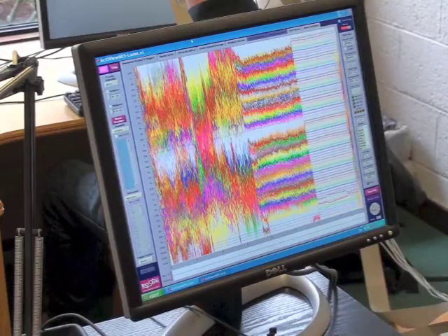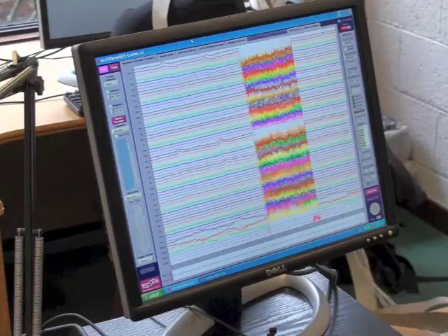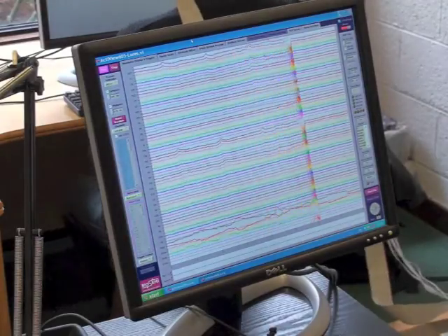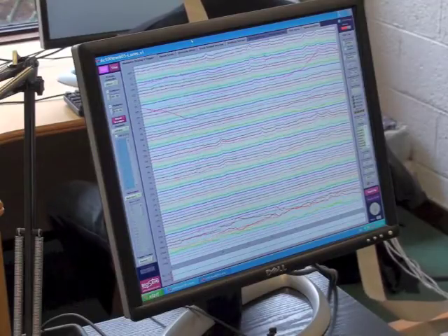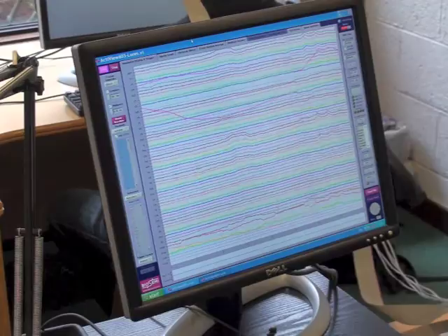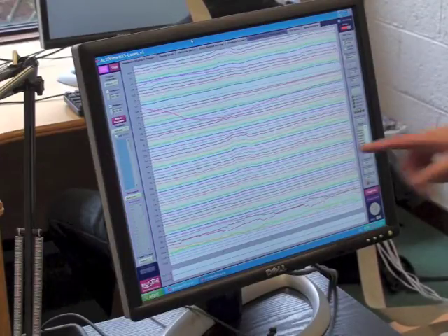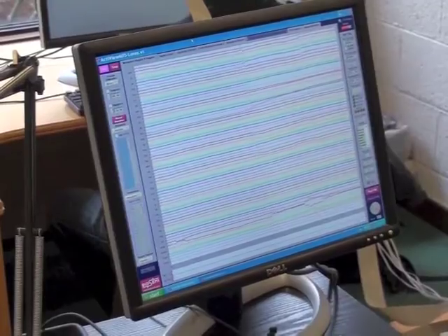Can we get Brendan to move a little bit? If you want to get disrupted data, if you put a mobile phone on near it, it'll, I probably don't know if it's going to work though or not with the mobile phone. So you can see he's knocked an electrode out there now. It's probably fixed itself. It was momentarily not picking up proper data.